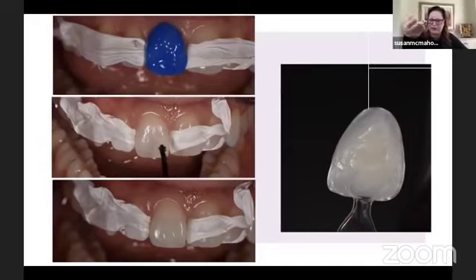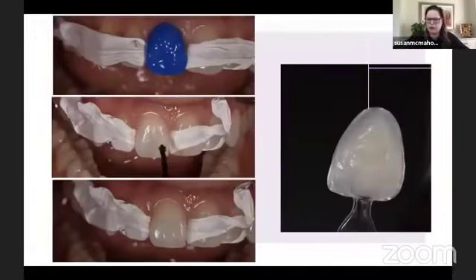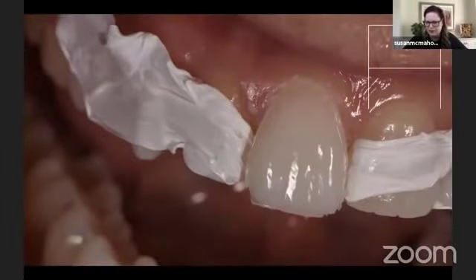So we isolate the teeth, we etch them, we put adhesive on, and then we cure the adhesive. And then we take our mold and smash that composite into it, really overbuild it a little bit. And then very scientifically, take our mold and smoosh it onto the tooth, making sure there's no air bubbles on there. You take an explorer, you clear off the excess. And that's what it looks like when it comes off.